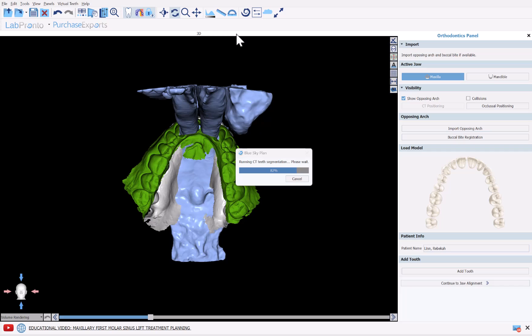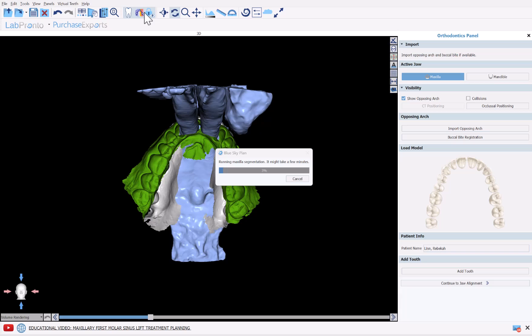Do you want the airway segmentation running with every case? Yes or no. Do you want the bone segmentation running with every case? Yes or no. So you'll be able to set your preferences based on your clinical applications, based on the power of your particular computer, and whatever other considerations you may have. You can see the software has now moved on to running the bone segmentation.